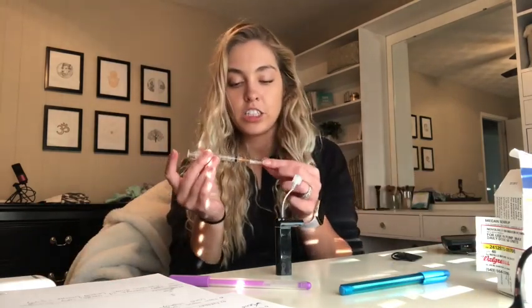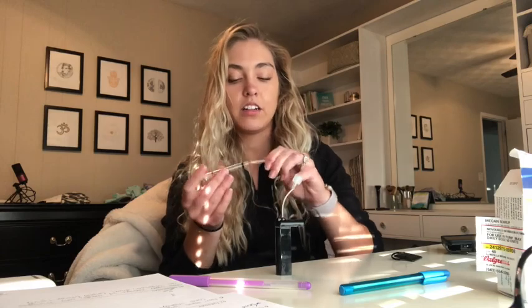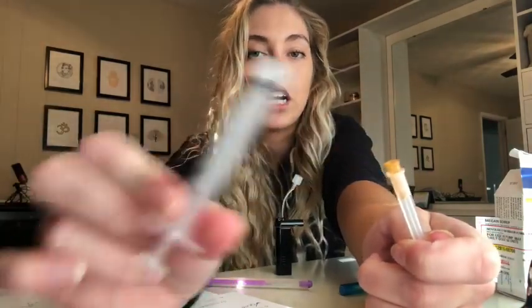Recap the syringe so I don't have a needle just kind of hanging out. I take the needle off and I just throw this into my sharps container and then I can throw this portion of the syringe in the garbage or the recycle.